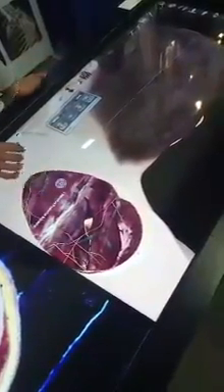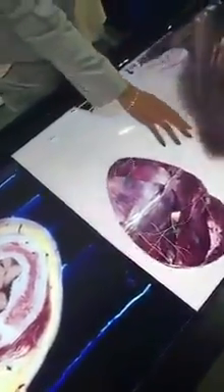You can go ahead and remove structures here and press the undo button. What's interesting is these are actually the scans done from the cadaver itself. Everything you see here is what we captured at 0.6 to 0.8 millimeter thickness, so each time I turn around and slide through these sections, I can see exactly where structures lie.